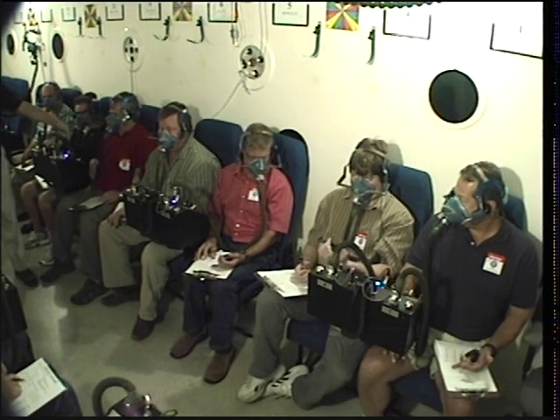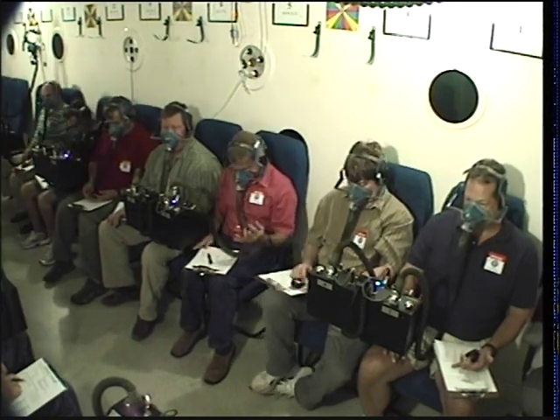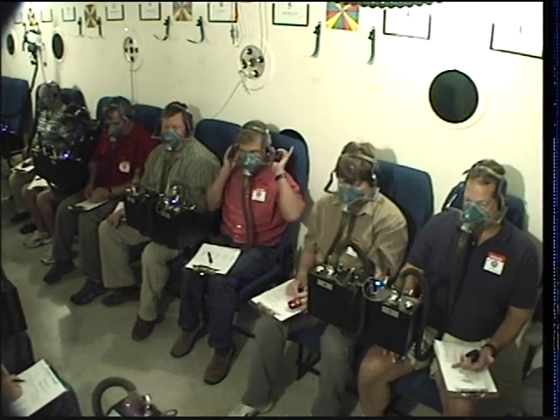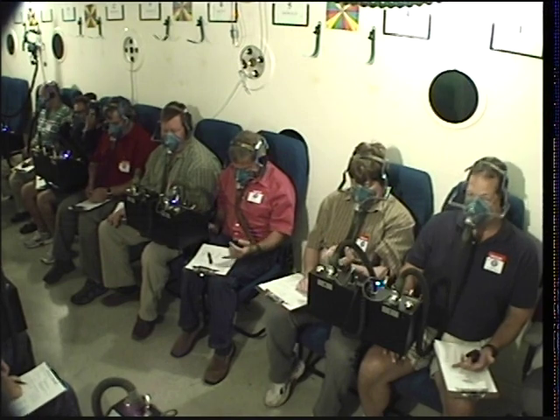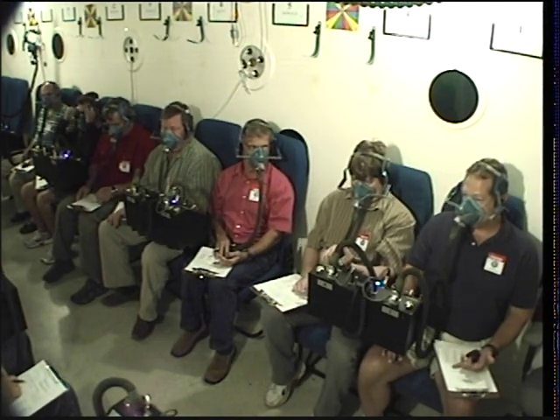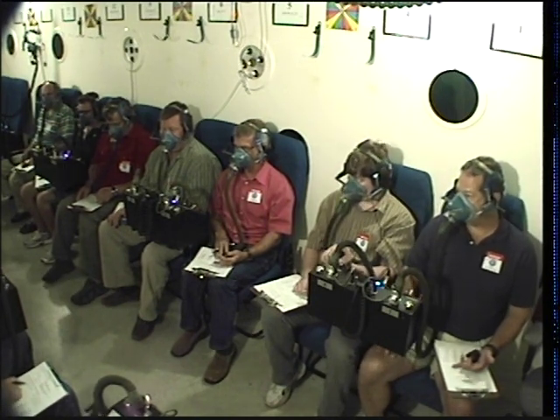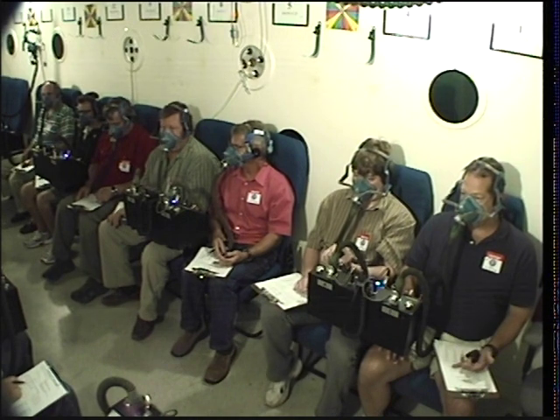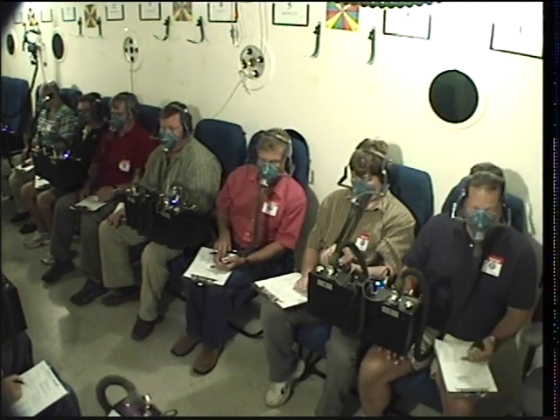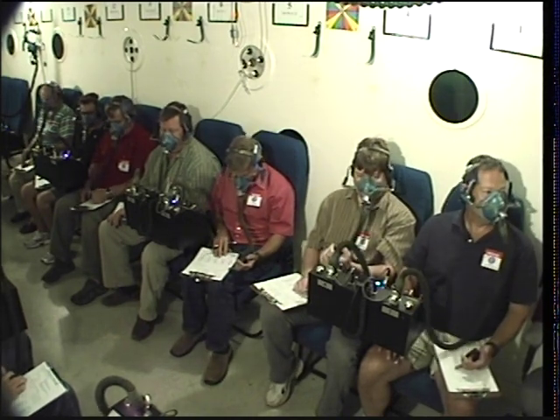Go ahead, Raj. All right, you back with us, Shane? Is the tingling going away? No, still a little tingling. Yeah, let's give it a little 100%. Just slow down the breathing rate a little bit, okay? Steve? Yeah, I'm good. You're good? Very good. And Gary, you were back to normal? Yep, I'm still good. All right. Shane, is it getting better? Yeah, it's starting to get better now. Tingling's going away? Yes, sir. All right. If it gets any worse, you let JR know right away, all right?